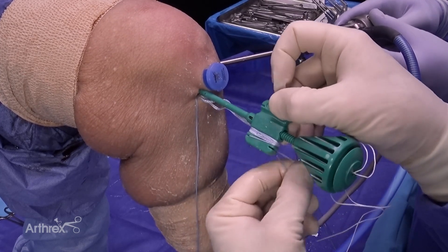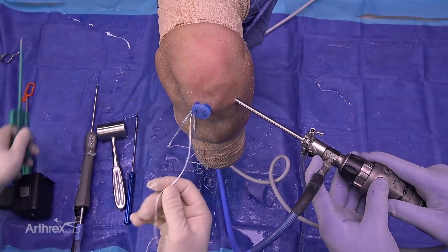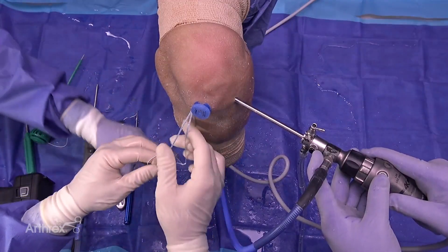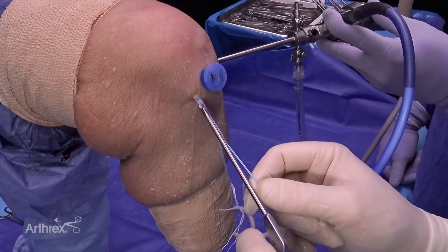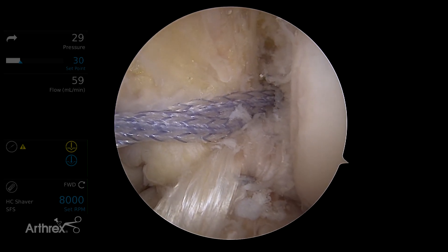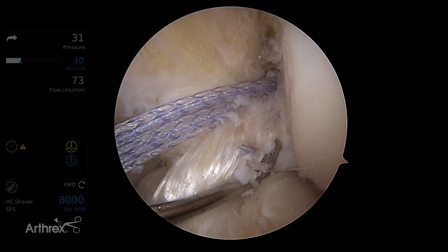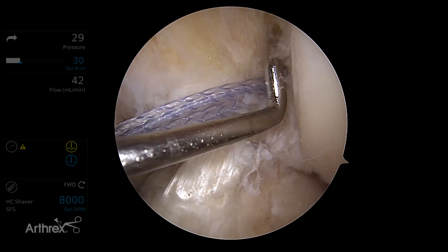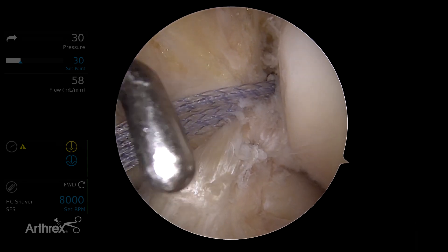Make sure we un-cleat our fiber tape. We don't want to pull the swivel lock out. We'll take our handle off and remove our core stitches. Occasionally you can use the core stitch to pass back through the ligament and tie knots if you need a little extra fixation. We're going to take our open cutter and cut our repair stitch. Now we're just left with our ACL and our fiber tape. You can probe the ACL and see it's very taut up against the wall. Almost every single time after these suture anchors are placed, your Lachman exam is almost always negative. Now the fiber tape is going to be passed as backup fixation.